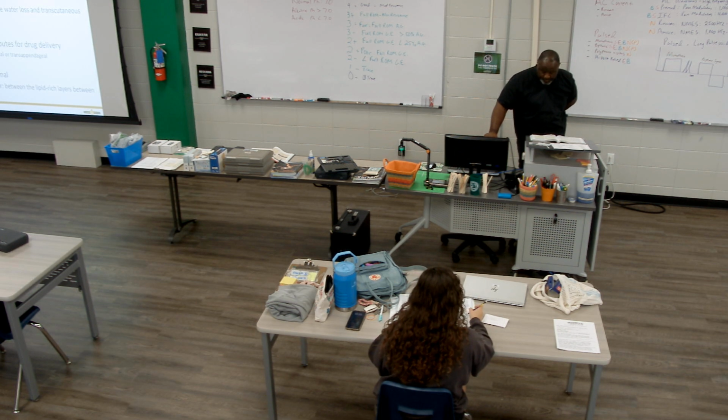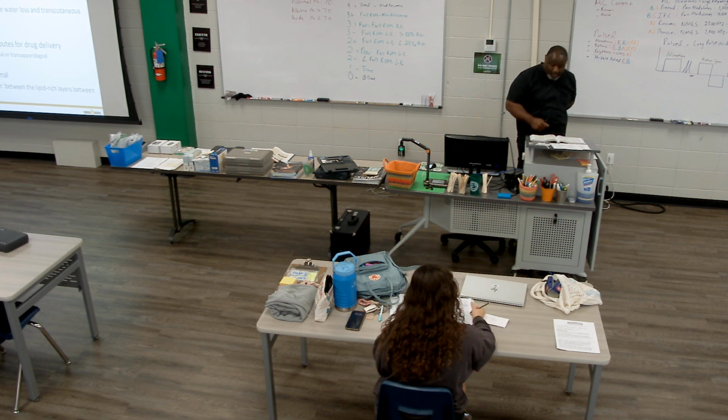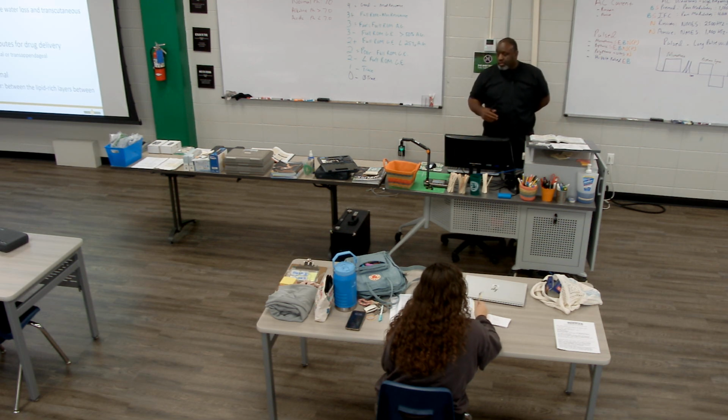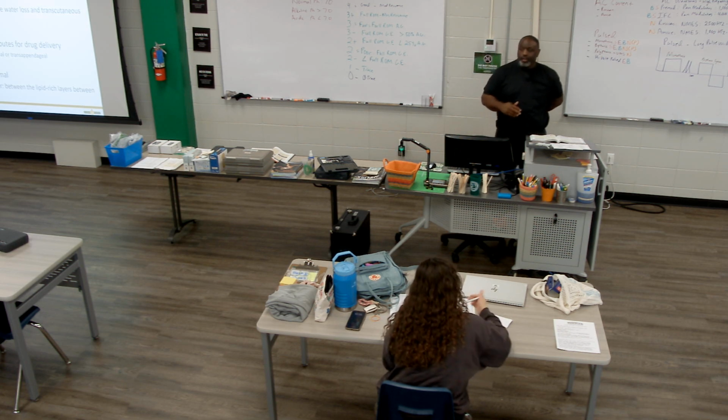It says, with iontophoresis, an electrode of the same polarity as the charge of the drug drives the drug into the skin via electrostatic repulsion. Highlight that, start it. That's the main concept of what we're doing.